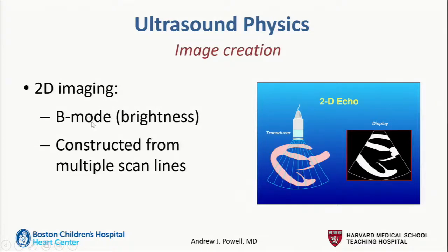And then there's 2D imaging. This is sometimes called B mode, and here the B stands for brightness. Here now you have a diagram of what's going on in order to make a 2D image. What it does is it draws the image sector by sector or line by line, starting at one edge and moving across to the other. So it draws this line really quickly, almost like a single M mode line, and then it does this one, and it does it sequentially.